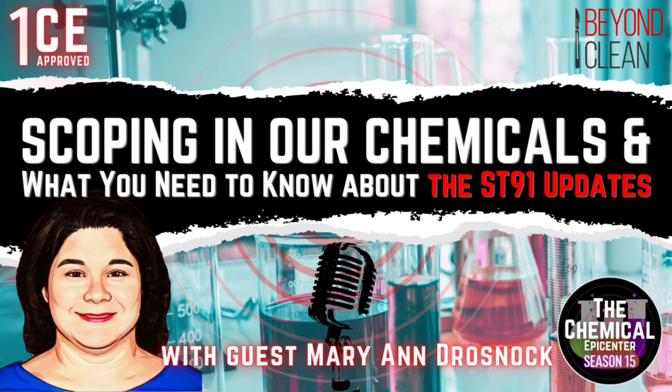You may have increased costs because of chemical compatibility issues, or sterilants are generally harsher chemicals and harsher processes. So you may see repairs happening more frequently or more quickly. So, thinking, I don't want my repair budget to go up. I don't want to lose track of those scopes, but really that's the way we need to be going. So look at that low hanging fruit. And if you have scopes that are compatible with sterilization, they should be sterilized. It boils down to that.